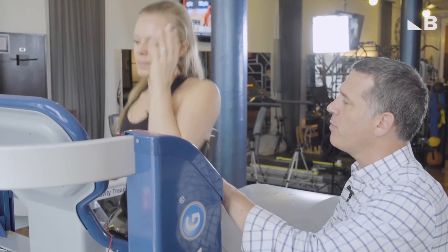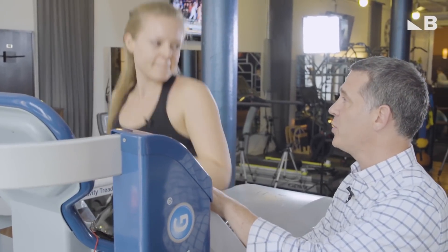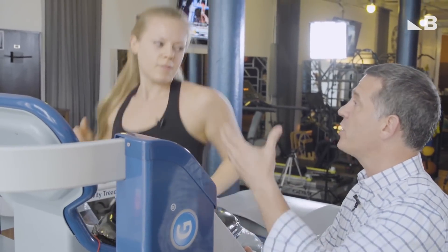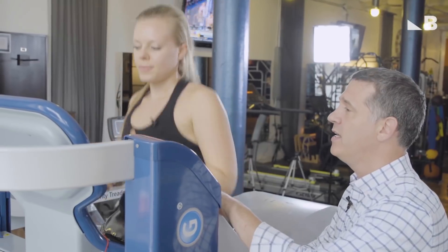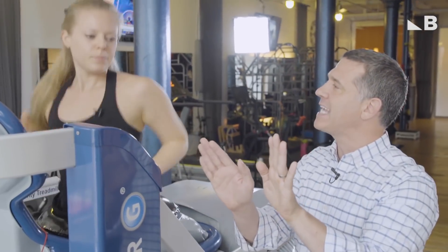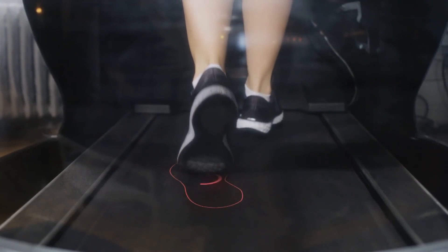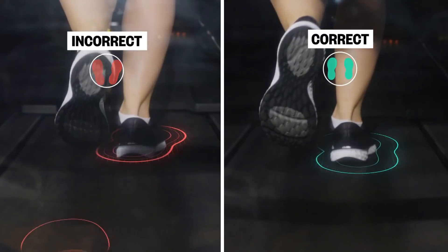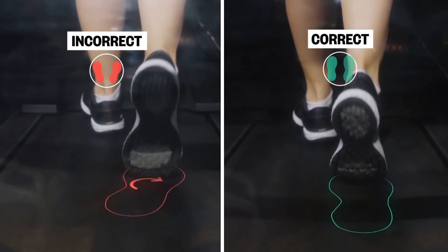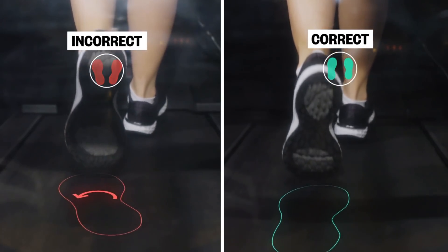During the evaluation we talked about a couple of things that you can work on while you're running, and this is a great tool because you have a lot more control than you would on a treadmill or outside. The first thing I want you to work on is that when you run you typically turn your feet slightly out — I want you to think about turning your feet slightly in. It feels really awkward, but because you're so used to turning out, it's going to feel like you're really turned in, when you're probably going to be more in a neutral position, which is where we want you to be.